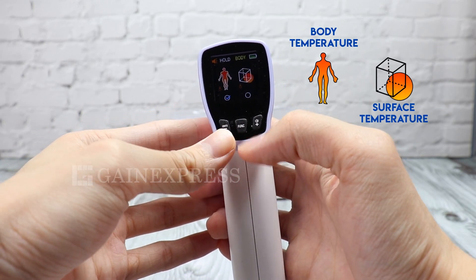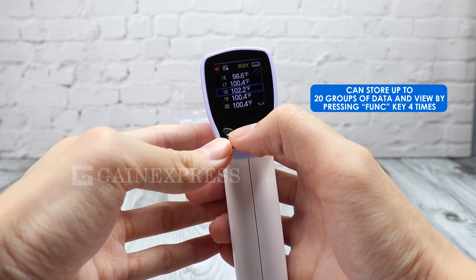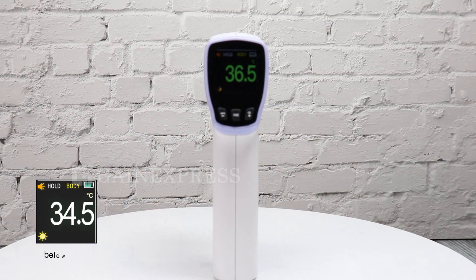To view the stored data, press the function key four times. You can store up to 20 readings. Pull the trigger to return to the measuring mode.